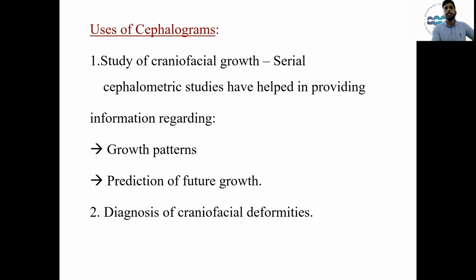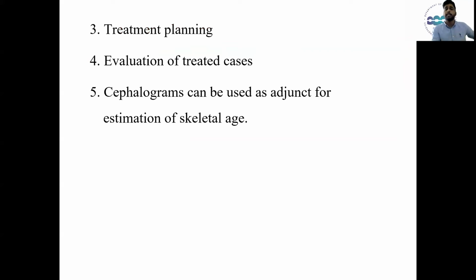Coming to the uses of the cephalogram, first is the study of craniofacial growth. Serial cephalometric studies have helped in providing information regarding the growth pattern of the patient, prediction of future growth, and how much growth is remaining. Second is the diagnosis of craniofacial deformities. Third is treatment planning. Fourth is evaluation of an already treated case, where we can evaluate the pre and post cephalogram. Next, the cephalogram can be used as an adjunct for estimation of skeletal age.